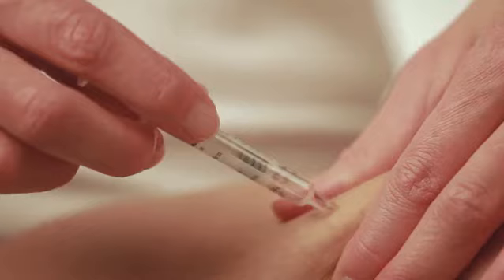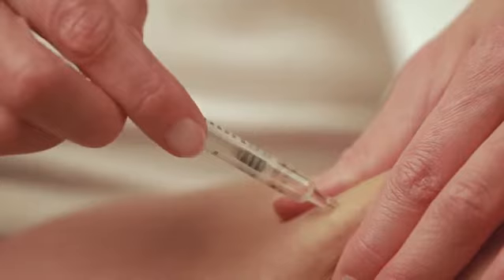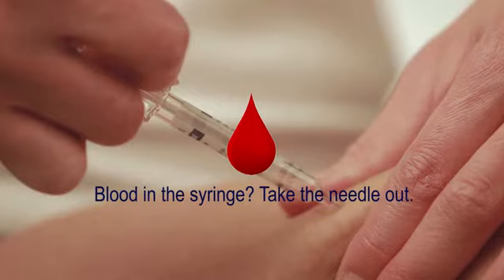Pull back the plunger of the syringe very slightly to be sure that you have not hit a blood vessel. Do not inject if you can see blood in the syringe.